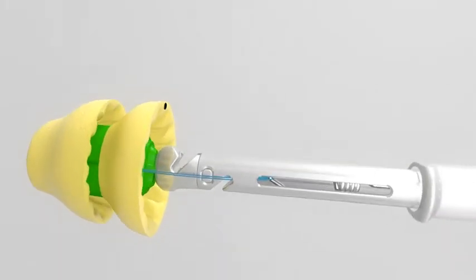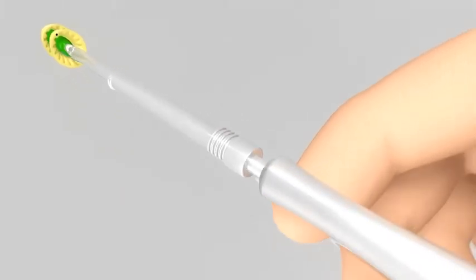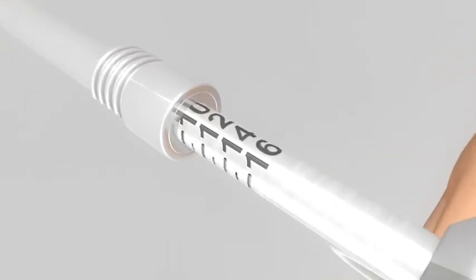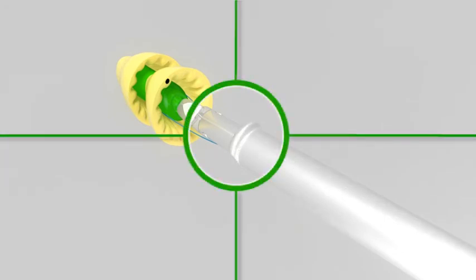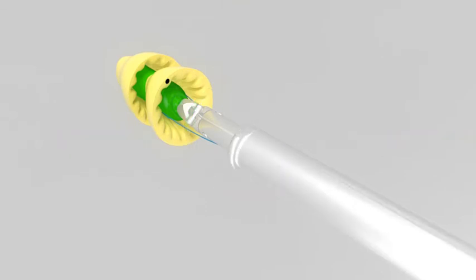Use the depth collar to set the maximum depth of insertion on the insertion tool. In this case, it is 10 millimeters. Remember to turn the sliding depth ring to the left side for the right ear and to the right side for the left ear, so that the ring faces the posterior meatus.